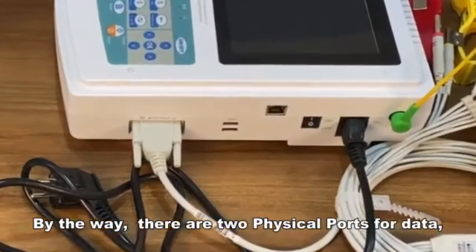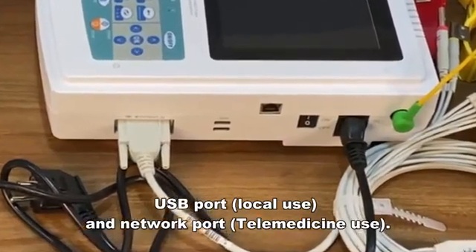By the way, there are two physical ports for data: a USB port for local use, and a network port for telemedicine use.